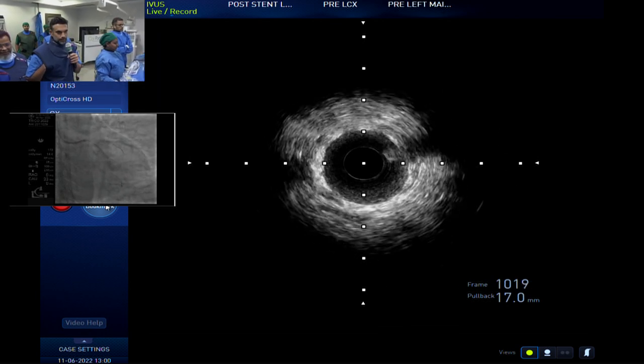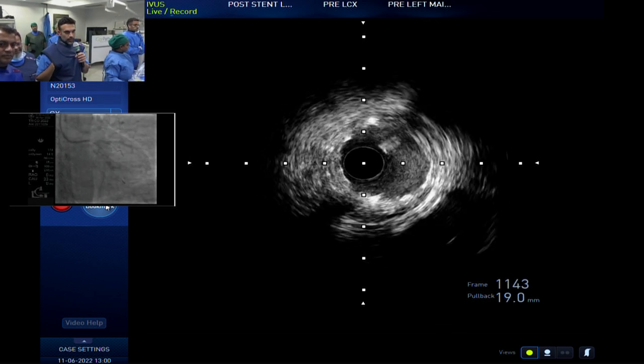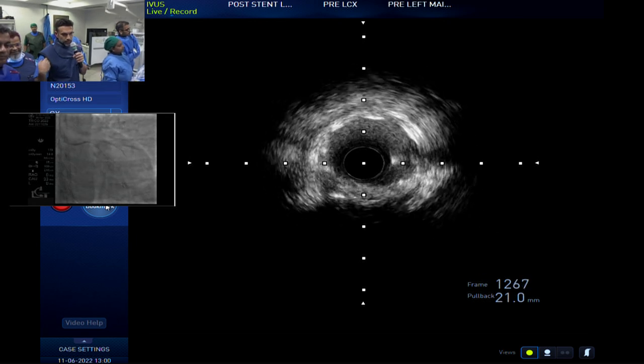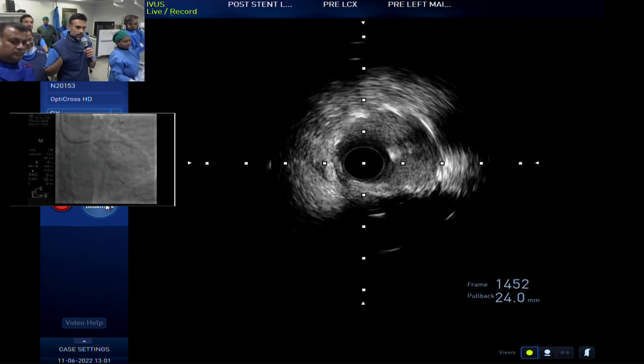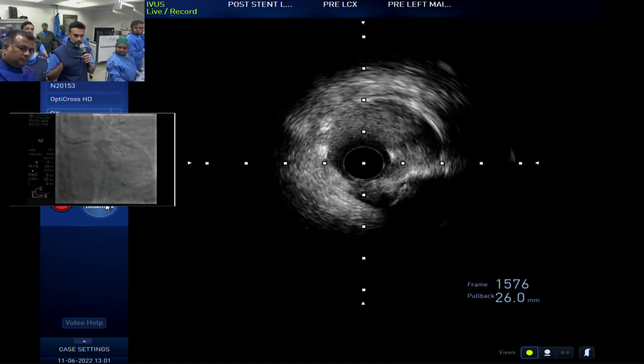I think this is very elegant. So this is very nicely expanded. Does anybody question that? And what you'll see is that the stent's going to get bigger as you get proximal. You could arguably make it a bit bigger here, but it's not so bad. Your minimal stent area is going to be well above your distal minimal lumen area, which is really what you're trying to aim for.